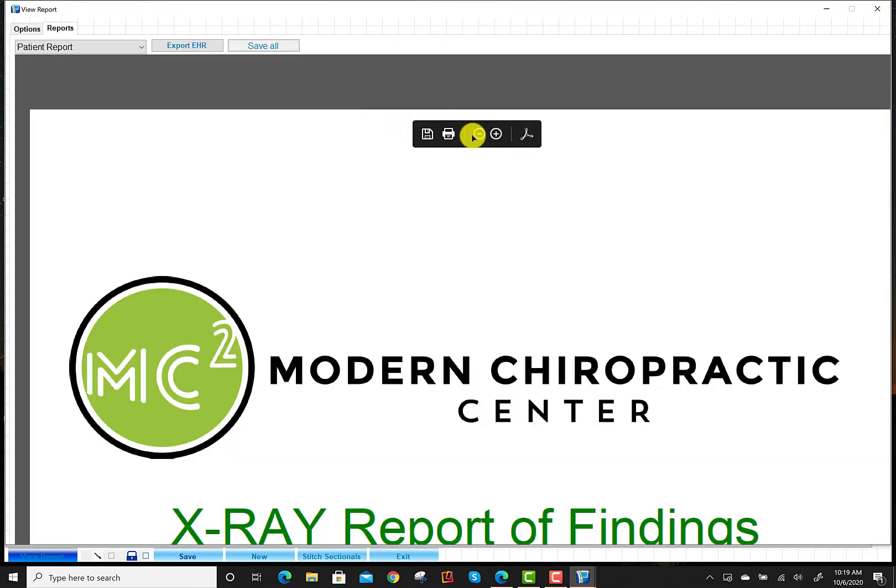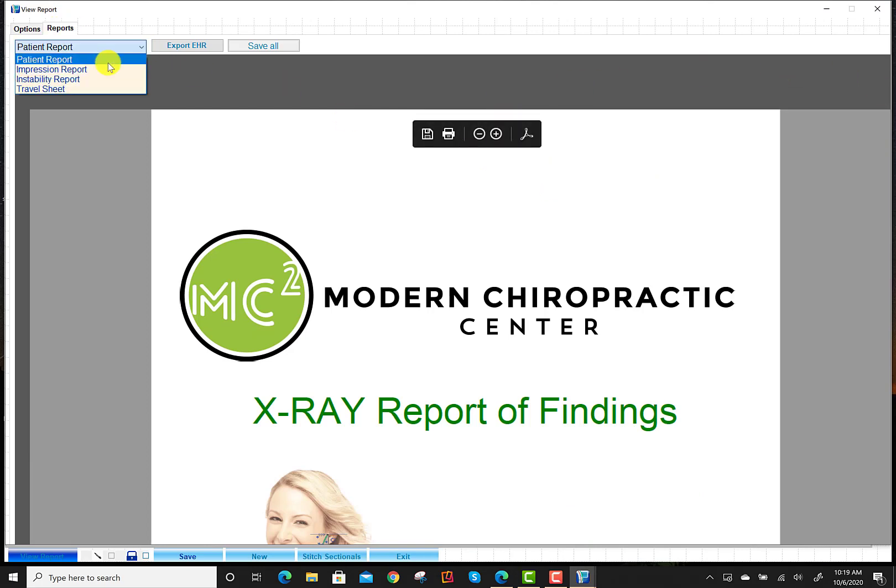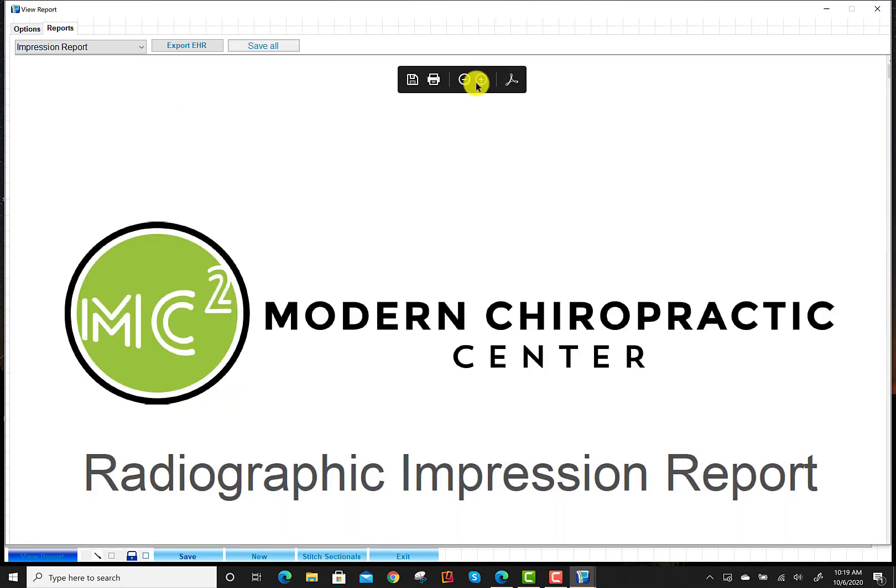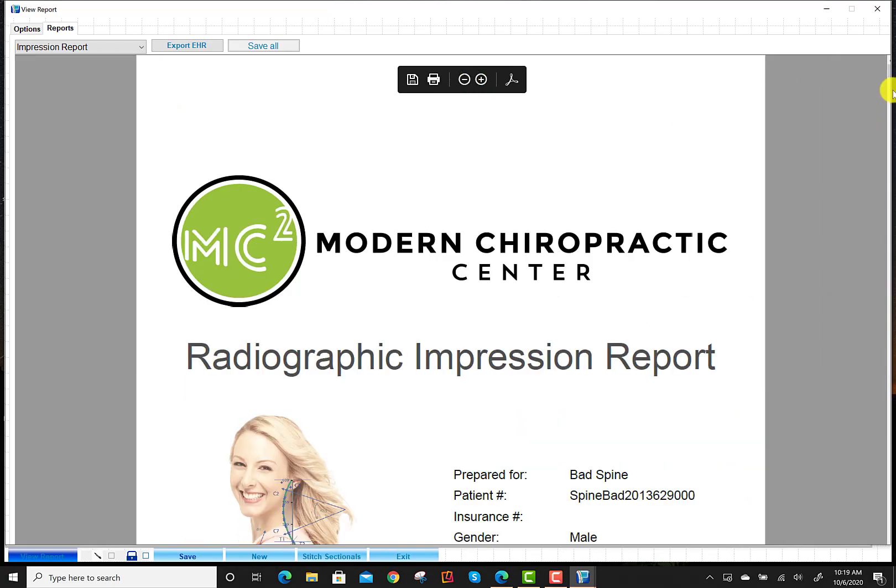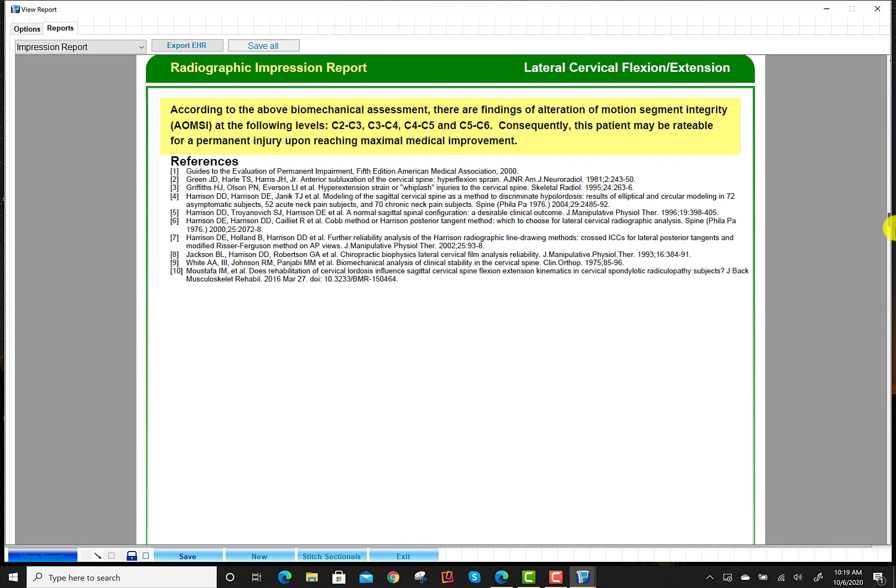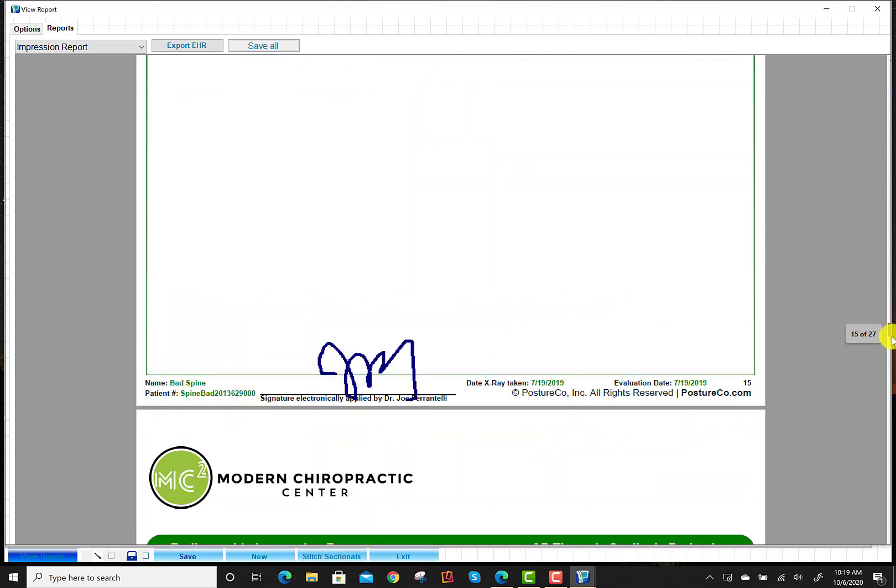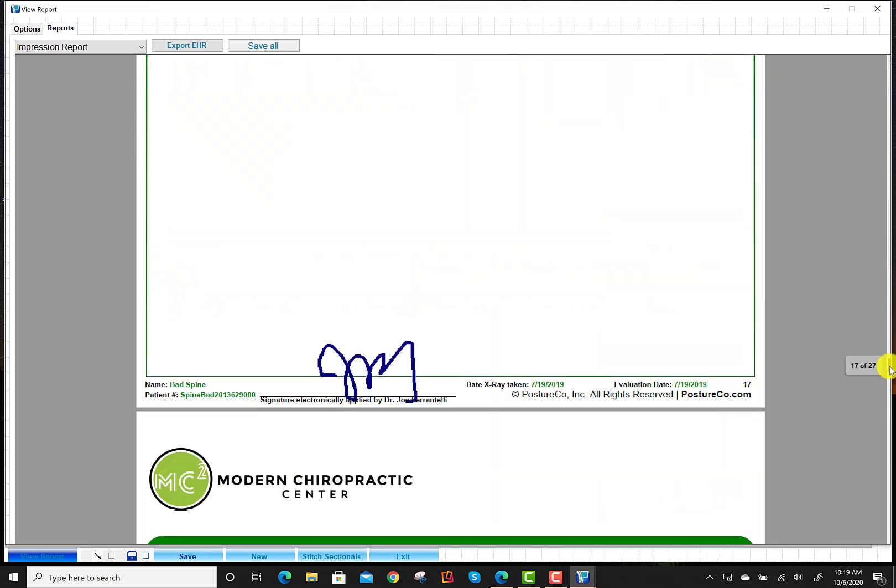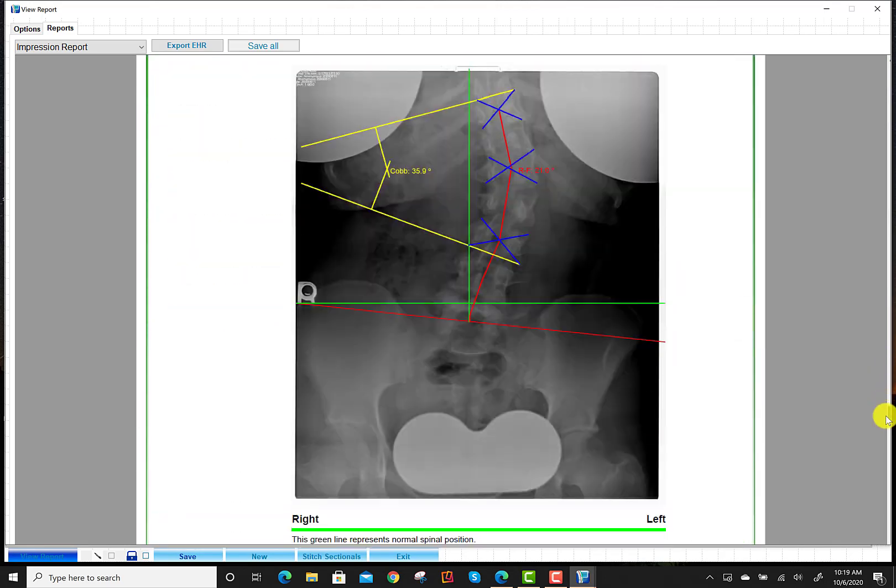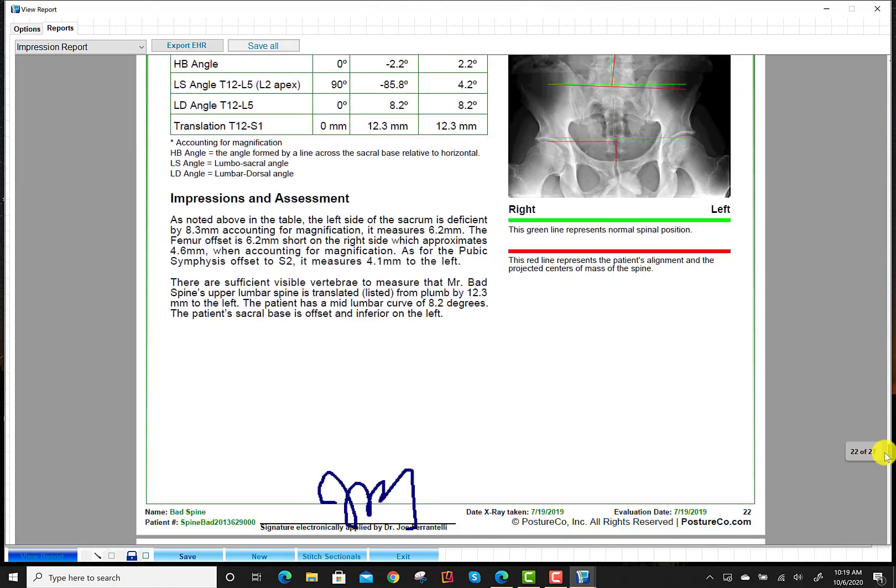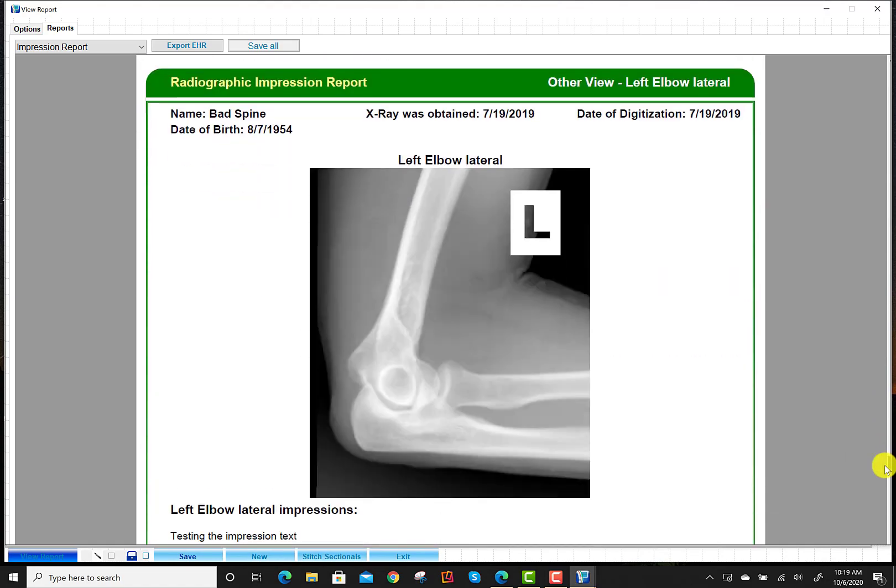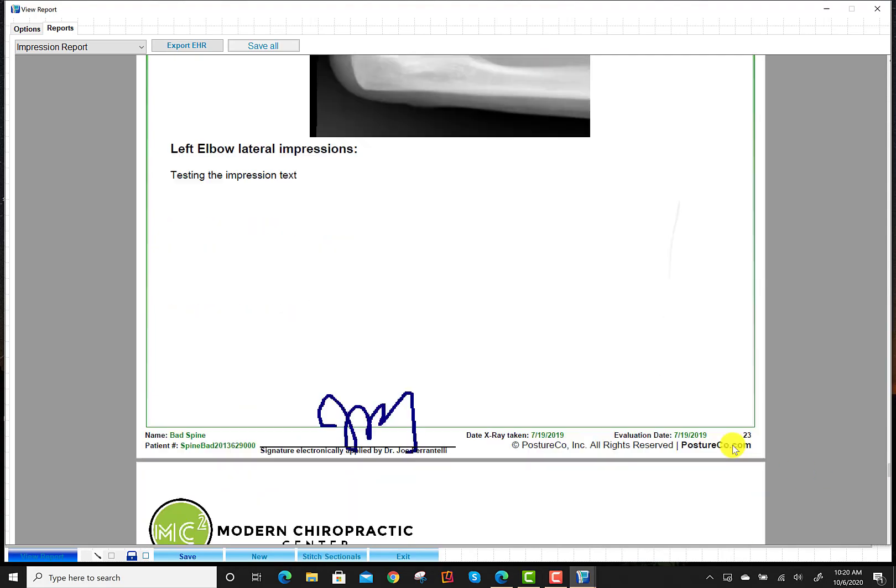So in the patient report, if we have that selected, actually, let me start with the impression report here. If we have this selected and I scroll down, I want to show you that we have these additional views on the impression. They'll be at the end. So when we get to the end, there's the elbow. Notice that we can put the text right here.